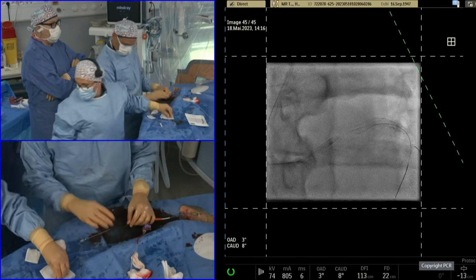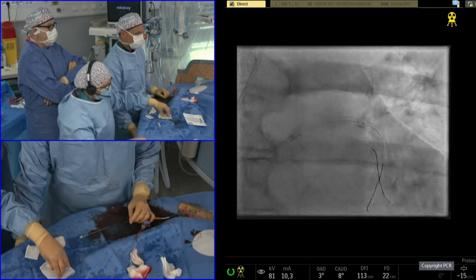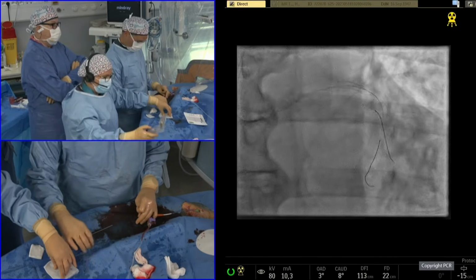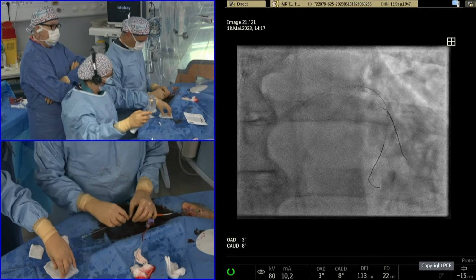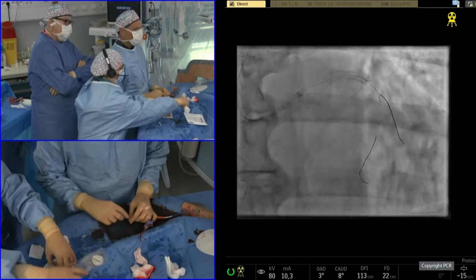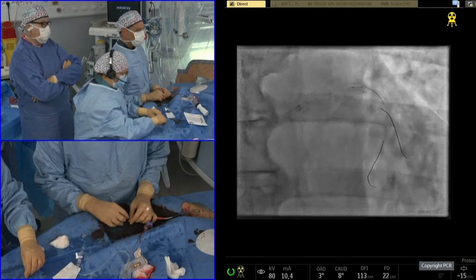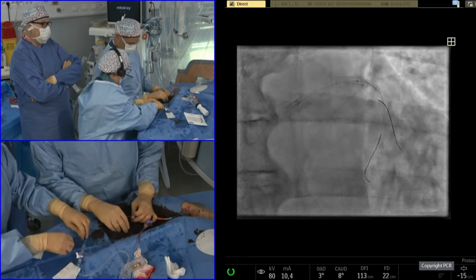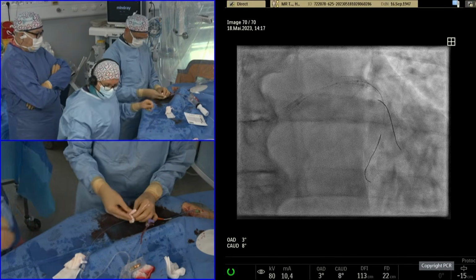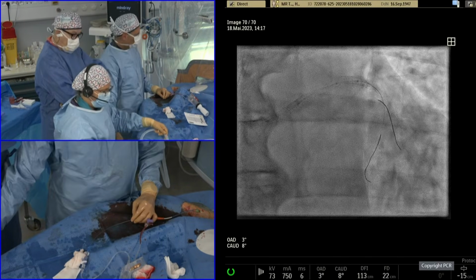Bernard, speaking from the experience of many years of doing KISS, the major benefit of KISS instead of just simple side branch balloon inflation is that in addition to optimal expansion of the stent in the polygon of confluence, you also position carina in the center. You will never be able with POT-side-POT to be sure that you position carina in the center. And from the perspective of computational flow dynamics, I think it's very important to maintain carina in the center. Do you agree with that?